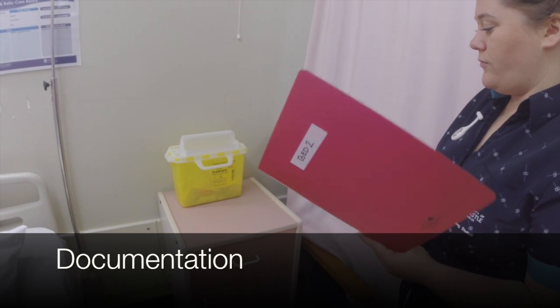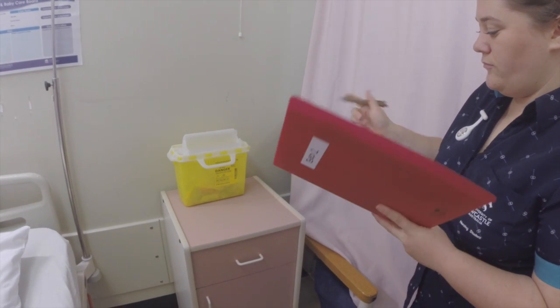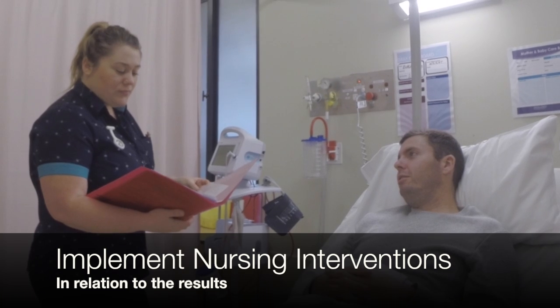Also document the procedure. Documenting the ECG includes the actual recording, noting the patient's identification details, doctor, date, and time. If there are any symptoms exhibited by the patient, nursing interventions need to be carried out.